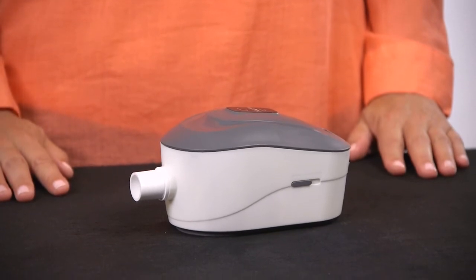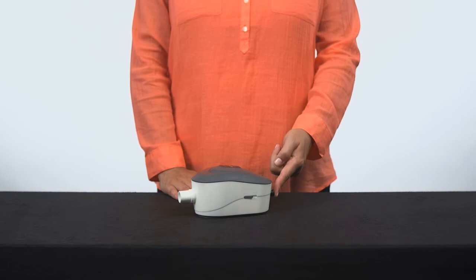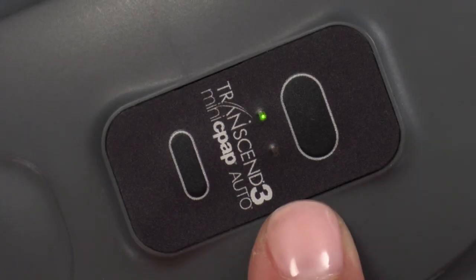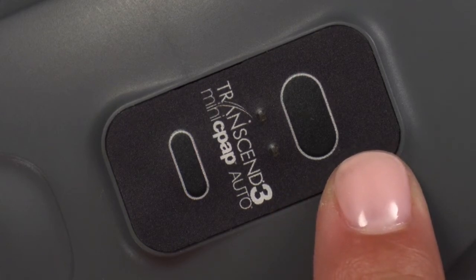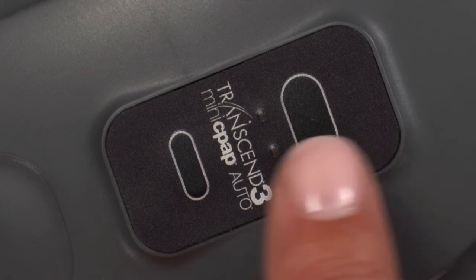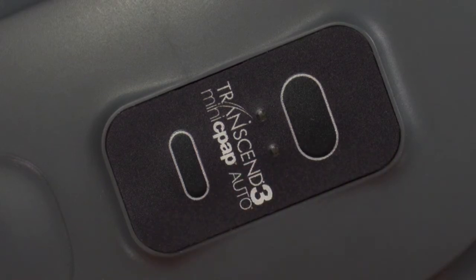Turning the device on is easy. To begin, plug in your Transcend 3 Mini CPAP. The LED lights will flash then turn off, signaling the CPAP is ready. Press the large button on top to begin therapy, then press the smaller button below it to enable the ramp feature once the CPAP is in operation.